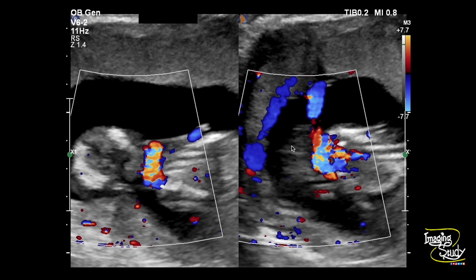This is the coronal section of the neck, and you can see the cord coming from the placenta and wrapping around the fetal neck. This is not the heart — this is the neck region. You can also see it clearly from this image: this is the fetal head and this is the thoracoabdominal region.